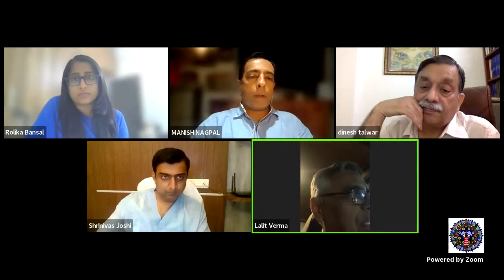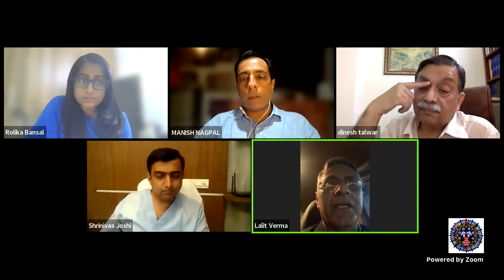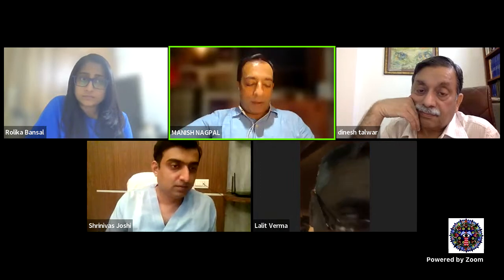Laser versus cryo is a big thing, because a lot of people keep telling in various webinars that with cryo you may have more PVR, with laser you may have less PVR. So, Shrinivas, what is your preference?